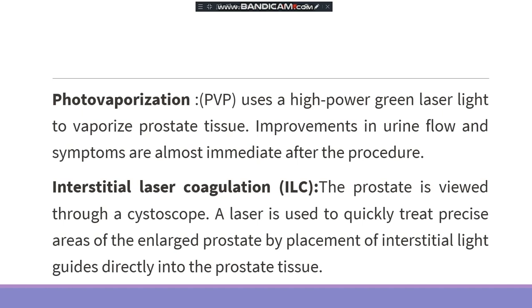The last one in minimally invasive therapy is interstitial laser coagulation, ILC. Here the prostate is viewed through a cystoscope, so direct visualization of the prostate is done, and a laser is used to treat the precise area of the enlarged prostate by placement of interstitial light guided directly into the prostate tissue.